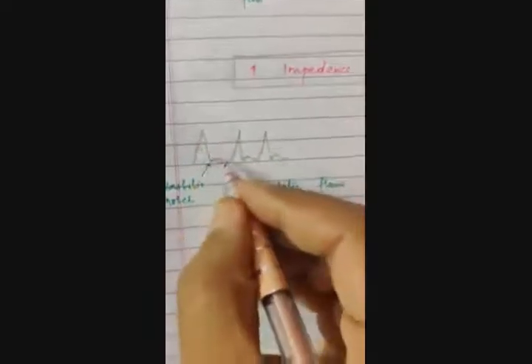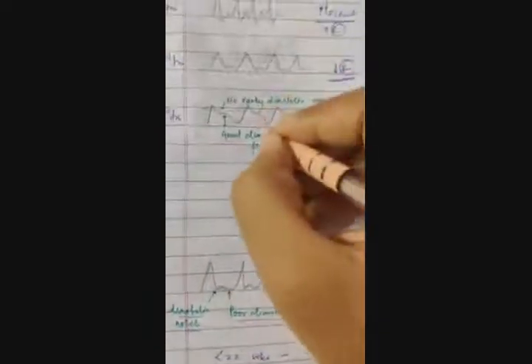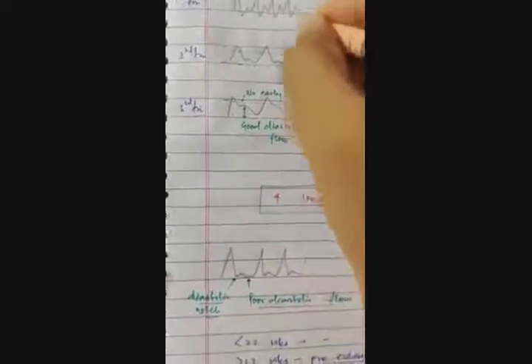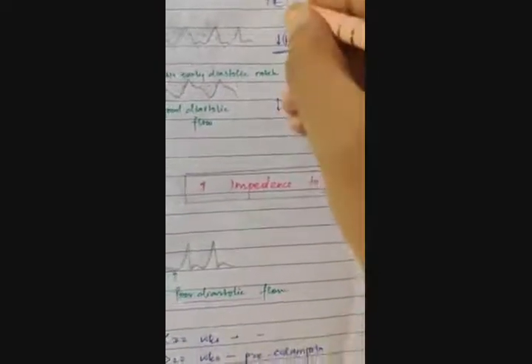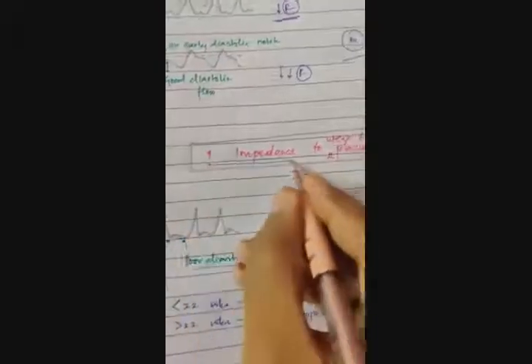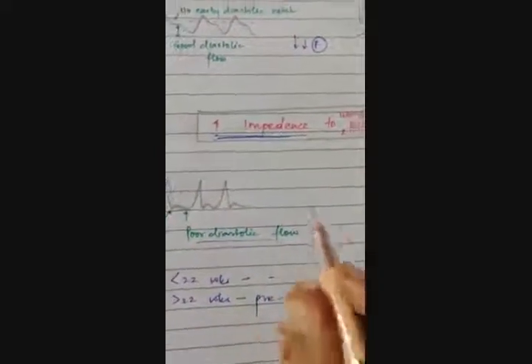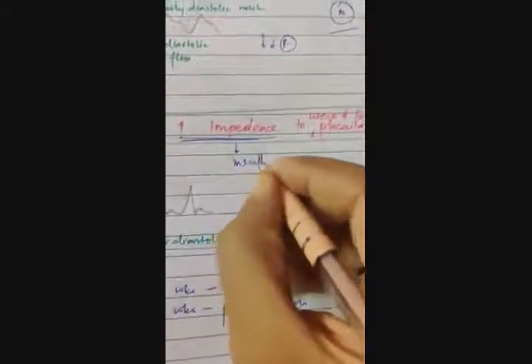This is our systole, this is our diastole, and you also notice a diastolic notch. Basically, from the third trimester waveform, it's as if we're going back, as if from a low resistance circuit we're going to a high resistance circuit, which is what the waveform is about, increased impedance. And this means insufficiency.